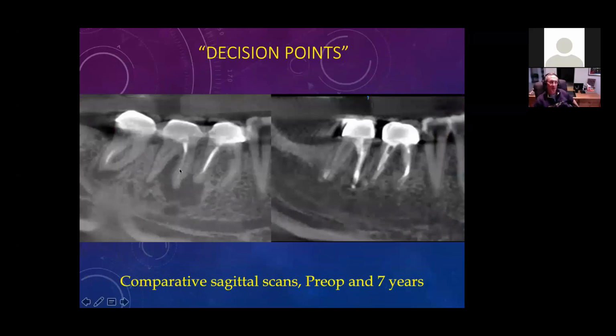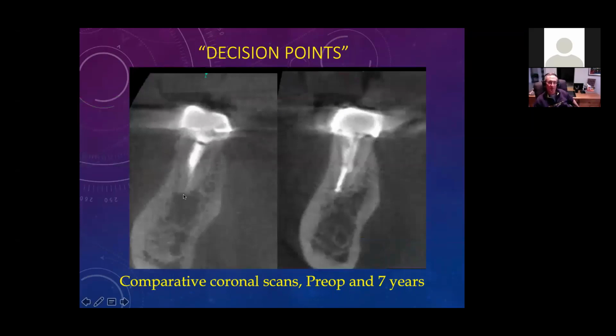And this is just a scan at 7 years showing the healing. And this is the interproximal view. You can see pretty much complete healing.